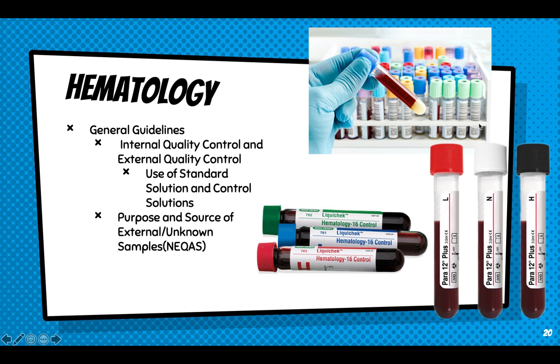Question, you in your PMLS P2: what is the test tube used, or what is the color of the top that is being used for complete blood count? 5 seconds, 4, 3, 2, 1. The answer is your lavender top. Your lavender top or purple top containing your EDTA, ethylenediaminetetraacetic acid. Another question: what is the most common form of EDTA being used in the CBC?